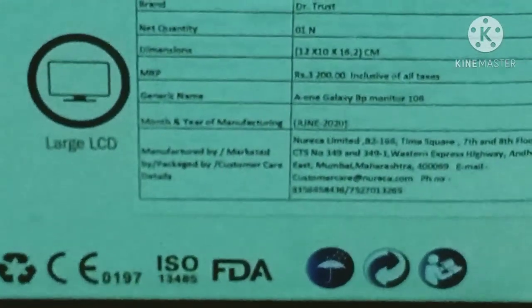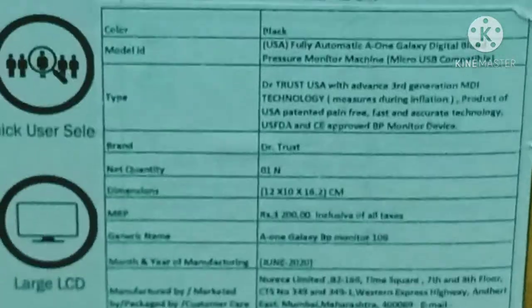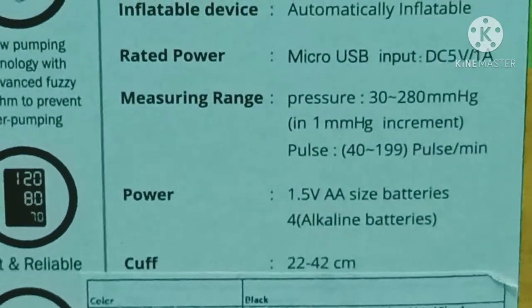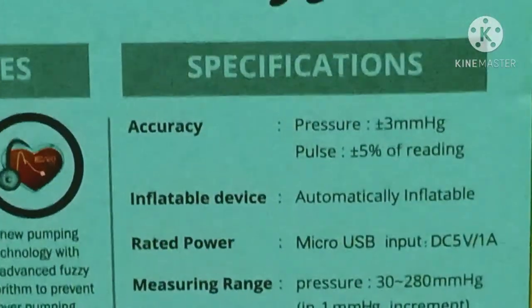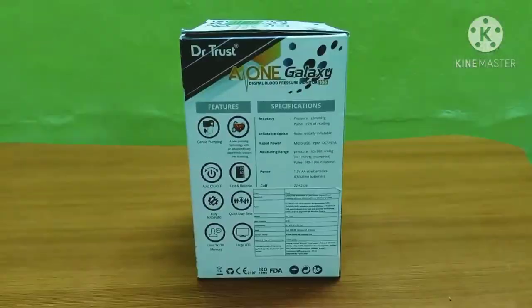This product is ISO and FDA certified. The cuff cover size is 22 to 42 cm. It has a micro USB port and correct pressure accuracy.